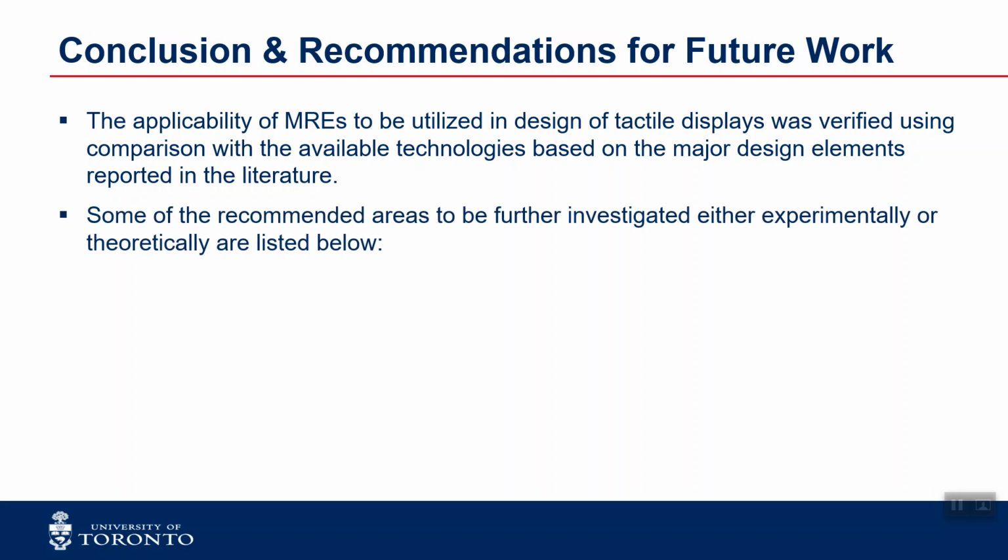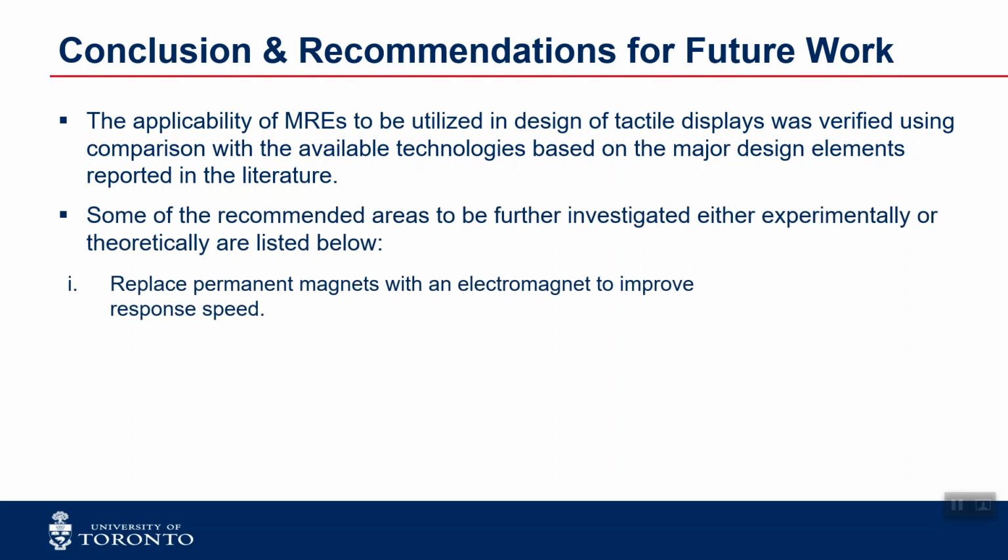Some of the recommended areas to be further investigated can be listed as replacing permanent magnets with electromagnets, as I mentioned, and adjusting the magnetic field direction to be in parallel with the motion. It has been reported in the literature numerously that in compression mode, the direction of the magnetic field should be in parallel with the motion.